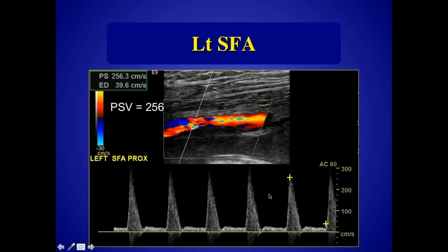And as we cross into the superficial femoral artery, we start to see changes. Notice that there's plaque, narrowing of the lumen. The color Doppler shows us that there's aliasing, right? This change in the color flow pattern. The aliasing indicates wraparound. We go from red to yellow to white to blue. That's what we're seeing here, due to the increased velocities across the segment.